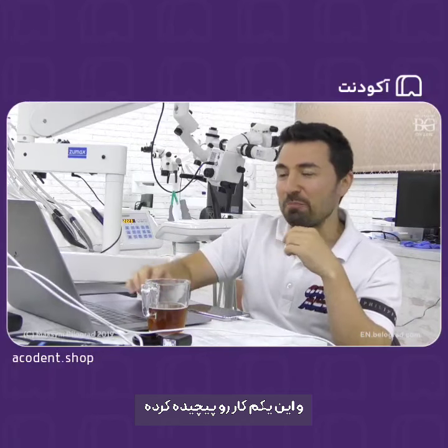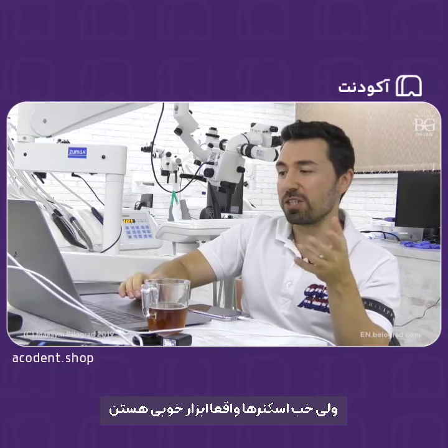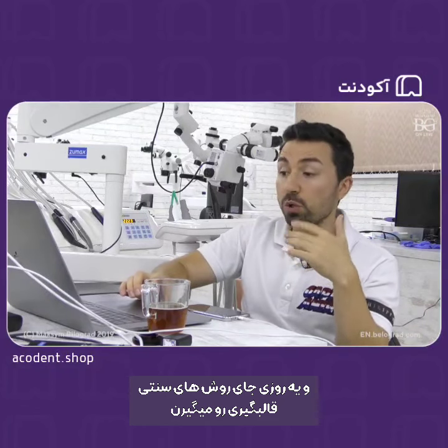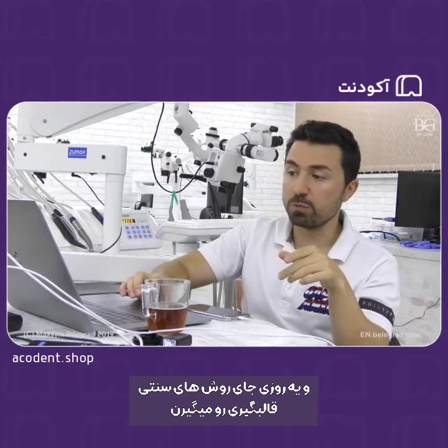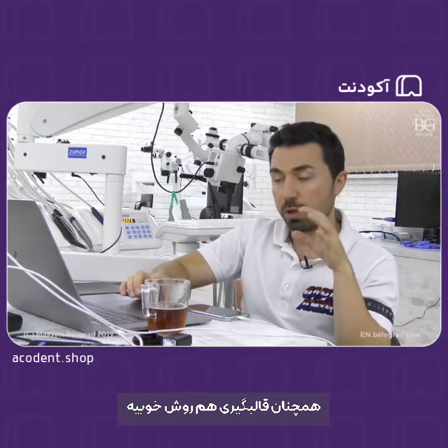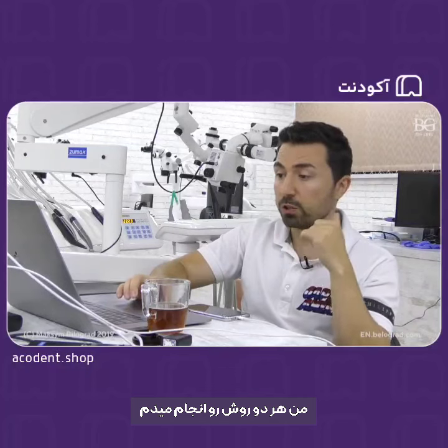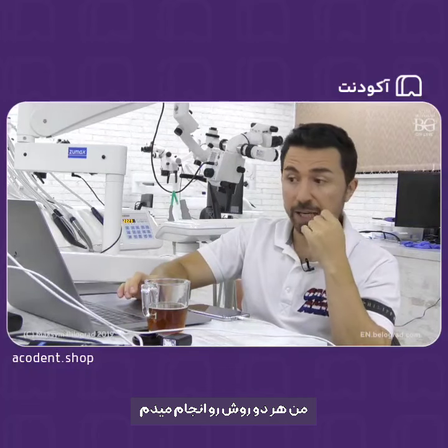This is a little bit complicated, but 3D scanners are really good things, and they will substitute, they will replace traditional impressions, but not now. Still, impressions are good options. Me, I do both. I take impressions and I do intraoral scans as well.